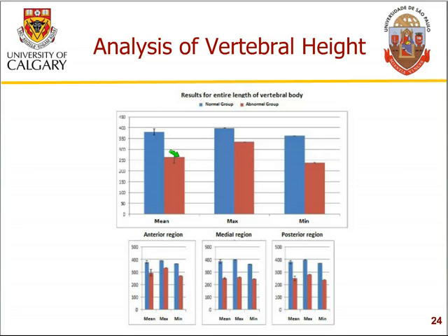And once the vertebrae or their plateaus are detected, measurements such as these become possible, and further statistical measures of variation of the height of each vertebral body could be derived. And such measures could be used to classify each vertebra as normal or not. This is where we are at this stage, and the work is still progressing.